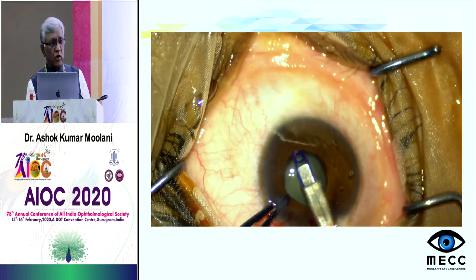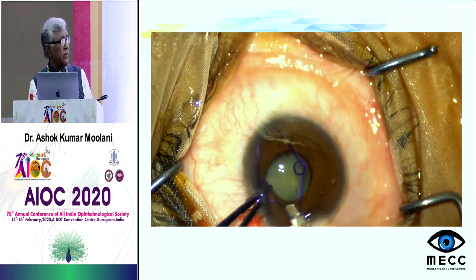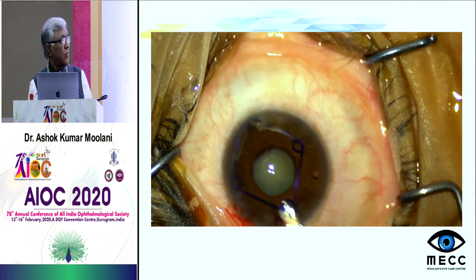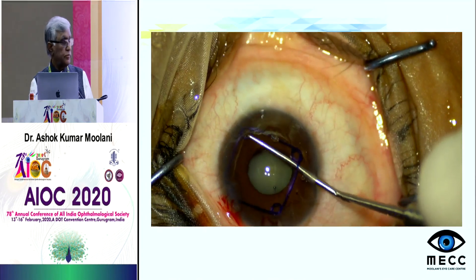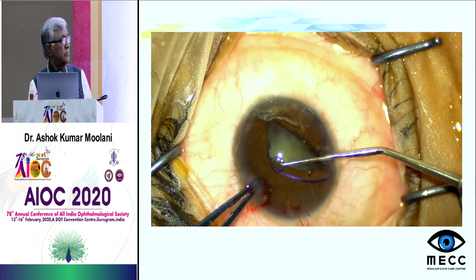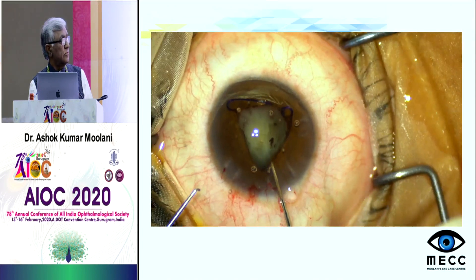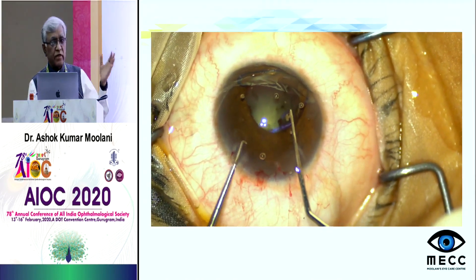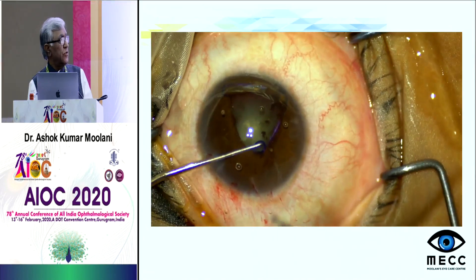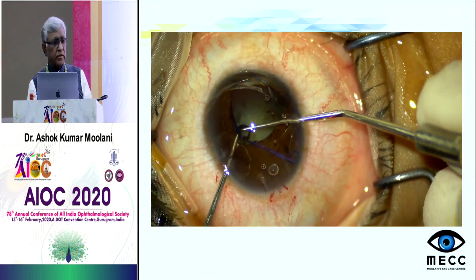Here is another patient with a small pupil, a hard cataract, and a white cataract. We were struggling to place the Malyugin ring, and during the process one of the scrolls went under the iris. We were unable to retrieve it, so in this unusual case we used iris hooks and the Malyugin ring together — quite unusual — and were able to perform the cataract surgery uneventfully.